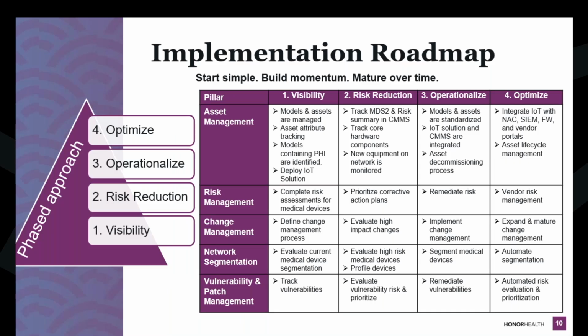Yeah. And not just how much we get reimbursed, but also how much do we pay? Because we have to pay cyber insurance as well, right? So how well you're doing in these categories will directly impact how much you're paying another company to insure you in case of a cyber risk. So those are all things. If you have any questions about this or doing an initial assessment, your CISO probably has some great resources on his team. There are assessments that the information security team goes through every single year, and Biomed is one of those areas that gets scored. So open that door, have that conversation, and ask, where are we ranking right now, and then identify those areas that you can grow in.